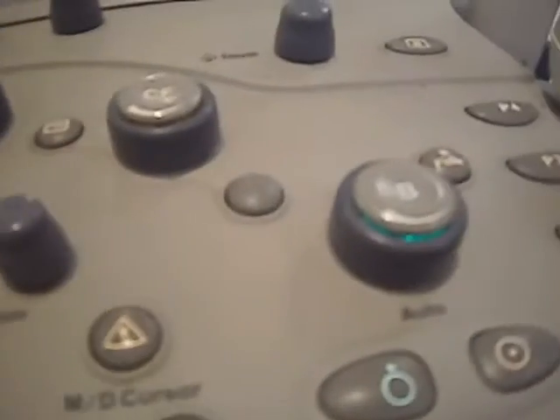Now these clocks here, if that's what you want to call them, actually hourglasses, indicate our focus. Right now our focal zone is anything between 1 1/4 to 2 1/2 or 2 3/4 of a centimeter. That's our focus. Right now you can see, right here, this is what was supposed to be the color map, but right now we are just in regular brightness mode.